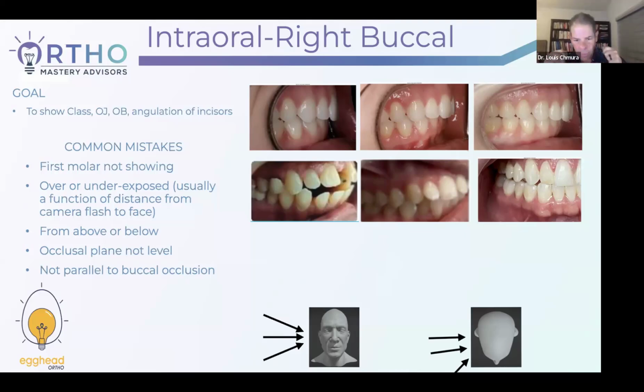And again, put both lip stretchers in, and teach them how to hold them out. They would hold them forward and out, and then I'd say, okay. And I wouldn't have them bite down till the last second. I'd get it oriented. I'd get it focused halfway, pressing the button halfway down. It'll start to focus. Say, all right. And on that one, you want to focus on the bicuspids or the canines. That's where you want to focus, so that you get depth of field.